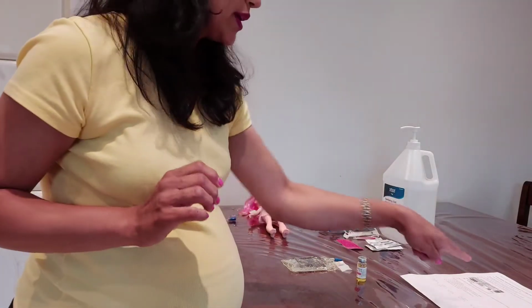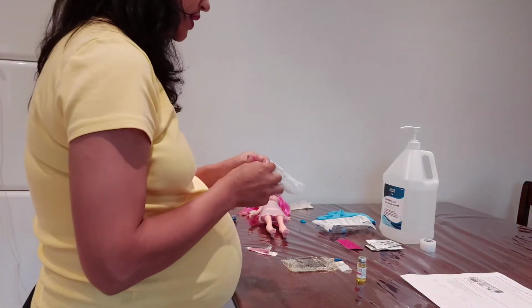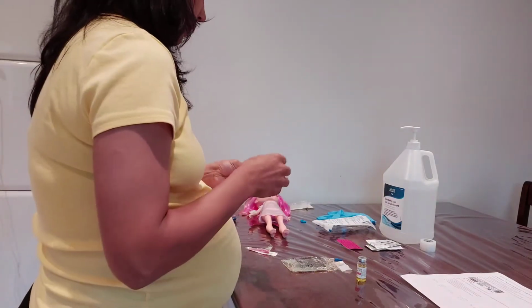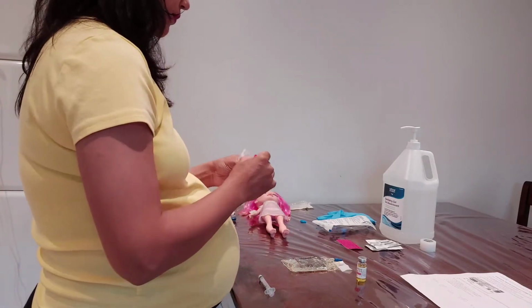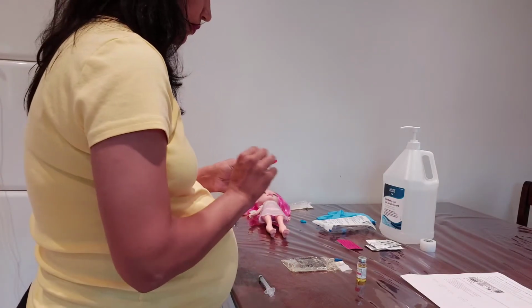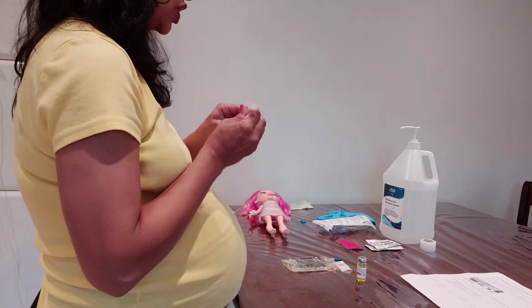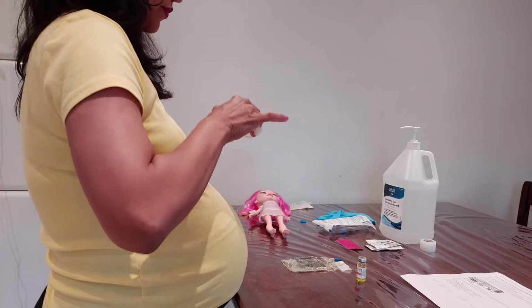As per the prescription, I need 3 milliliters of the medication, so I will use the 3 milliliter syringe. I will make sure not to touch the plunger of the syringe.